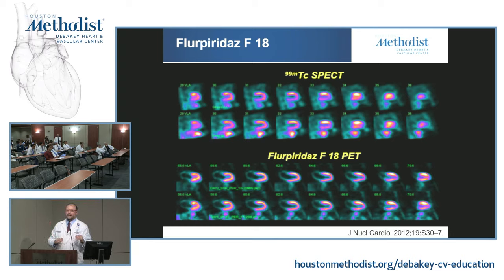And on any other indication, it can be whatever, either symptoms or you have a positive stress test, positive CT, positive calcium, positive rubidium PET, whatever you have an indication, we would like to have, at least for the patient, SPECT and PET, or if they have a SPECT, we'll not repeat it, and then we'll take the cath information.